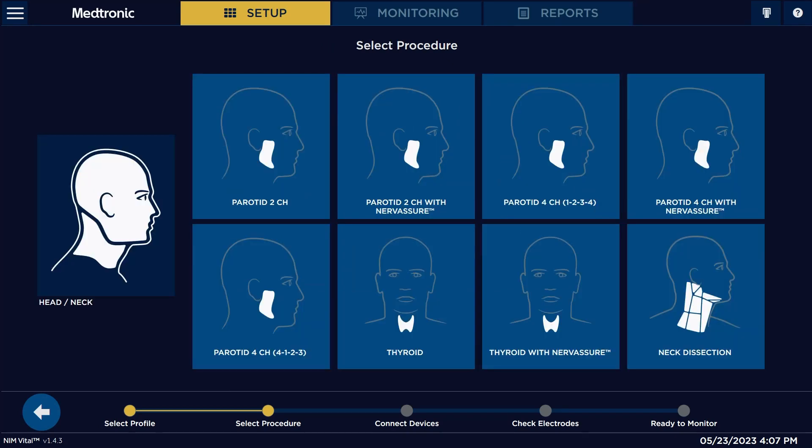Once we click on head and neck, there are several different options for parotid. There's parotid 2-channel, parotid 4-channel, parotid 4-channel 1-2-3-4, and parotid 4-channel 4-1-2-3. For this case, we're just going to pick parotid 4-channel 4-1-2-3.